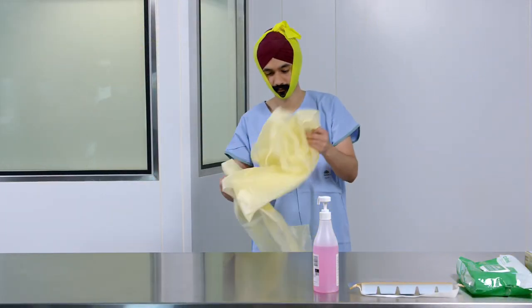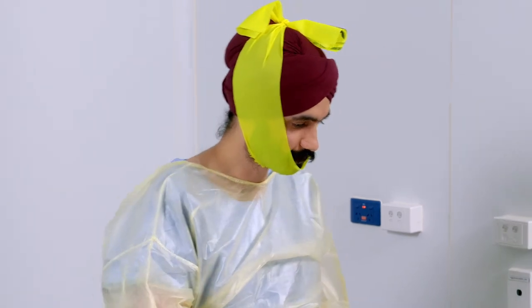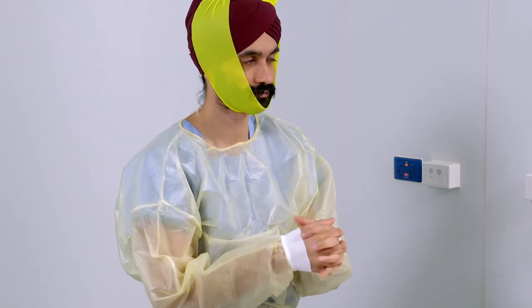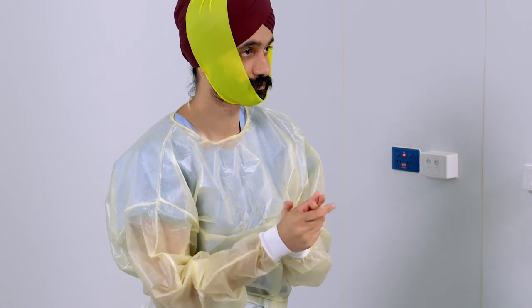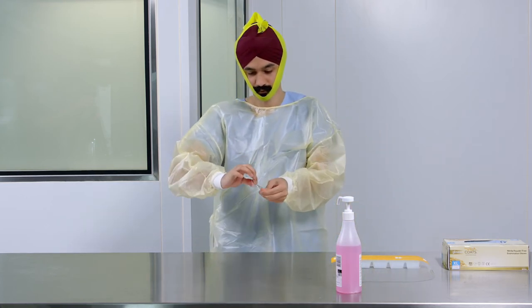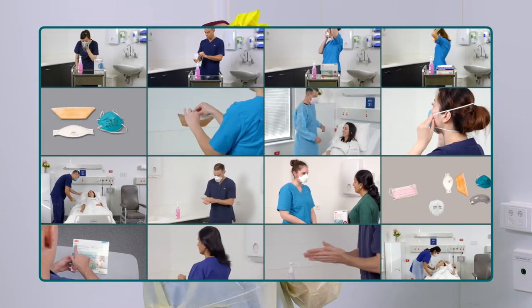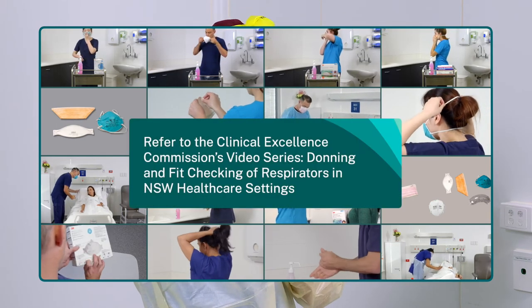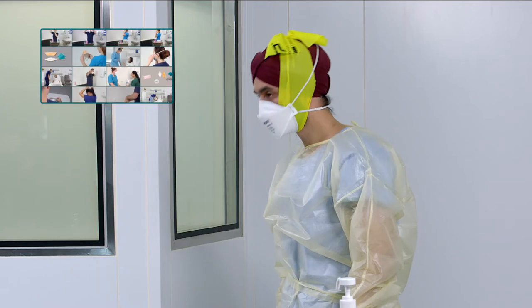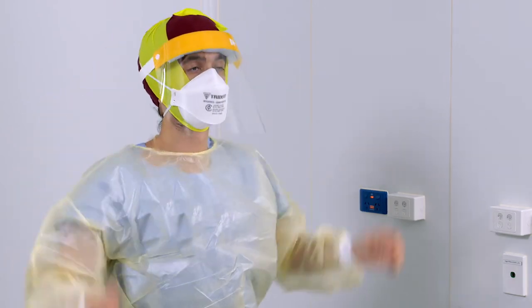Don a gown or apron based on the requirements for transmission based precautions in your work area. Now select the respirator which has been fit tested and recommended for you. For further guidance on donning and fit checking of P2 or N95 respirators, refer to the Clinical Excellence Commission's video series, Donning and Fit Checking of Respirators in NSW Healthcare Settings. Don other PPE as per local guidelines and the task you'll be performing.